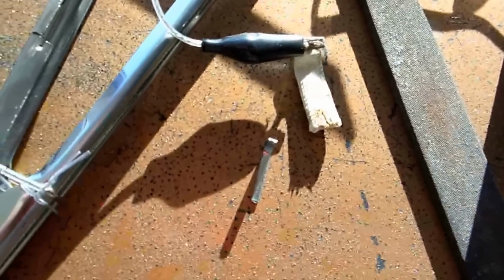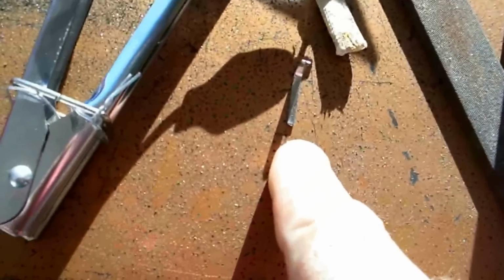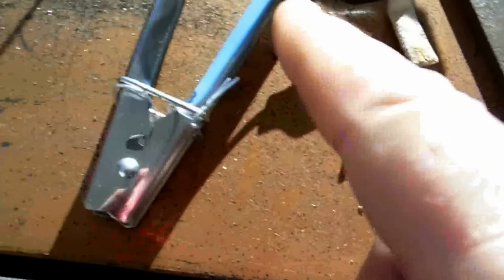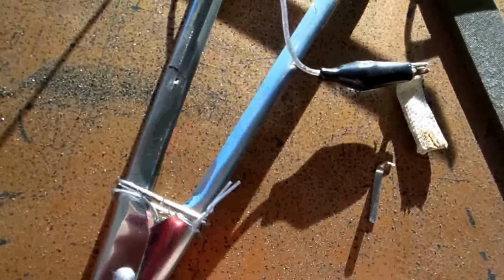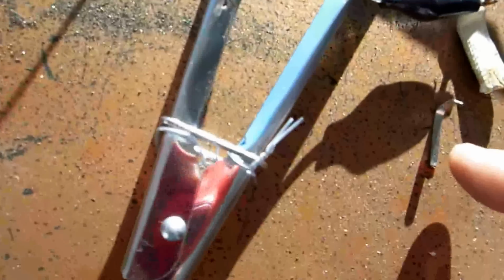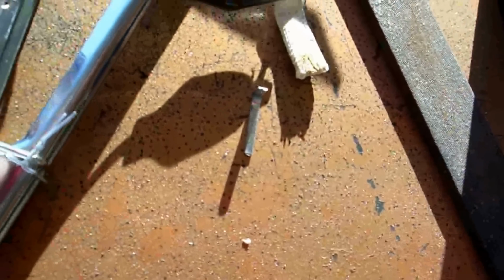So just a little tip. You sometimes wonder where the hell you get these little metal strips from. If you lose them or whatever, if it didn't come with the unit, you can make them. I just got these tongs from Walmart, stainless steel, 97 cents. Used the Dremel tool, just made a little cut along there, cut them to size, cleaned them up a little bit with a file. Perfect.